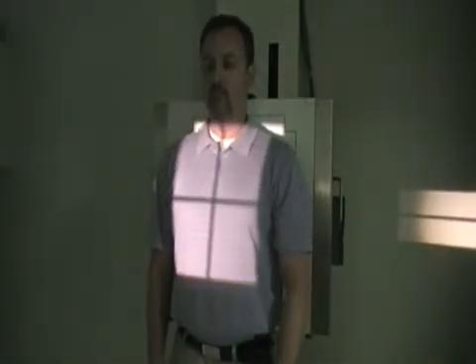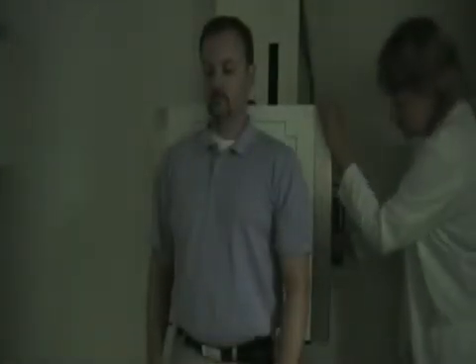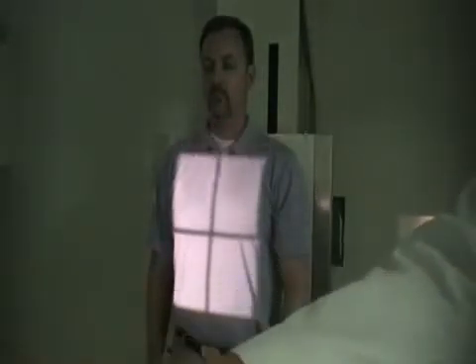One more note I'd like to make is regarding the lower ribs. When you're x-raying lower ribs, you would still do this in an AP position because the bottom two ribs are posterior. So to see those the best, you want to get that area closer to the image receptor. So again, I would bring this down to the level of his crest and then move the tube to meet that.